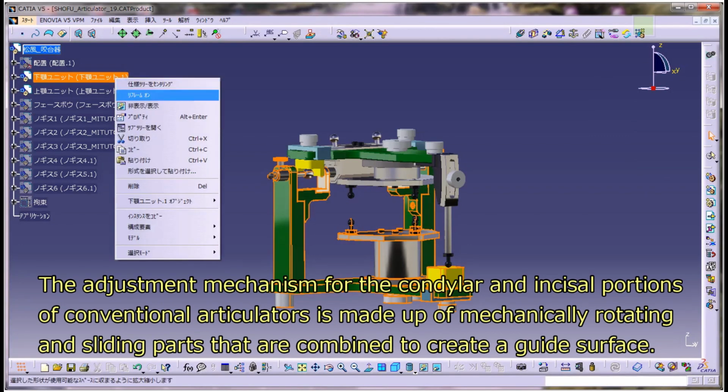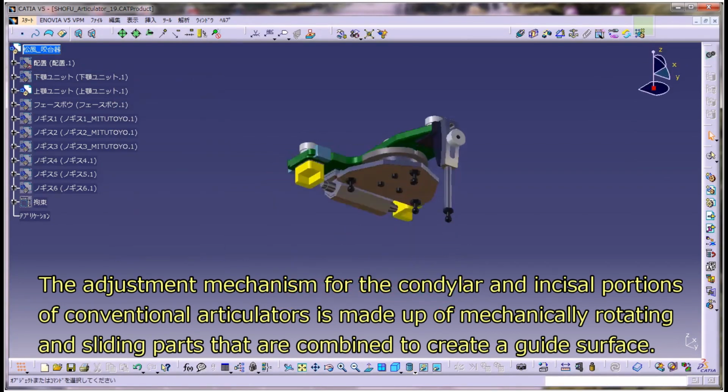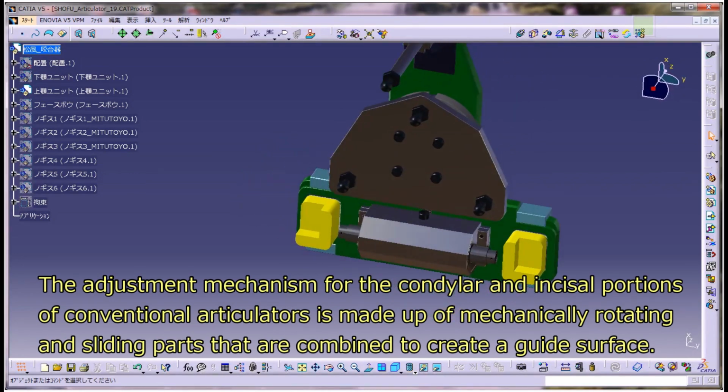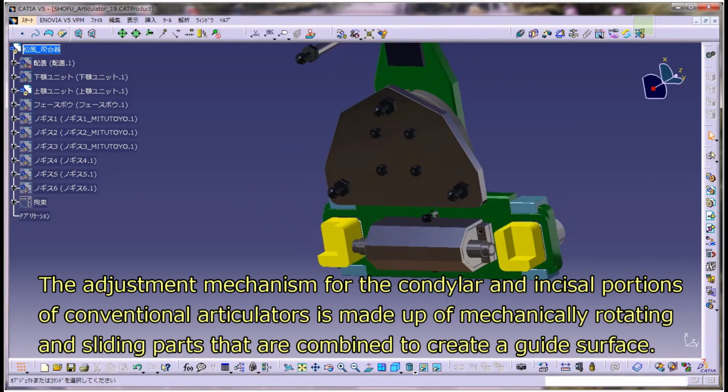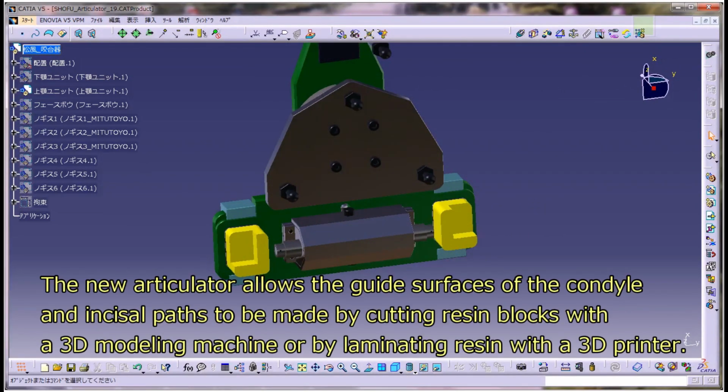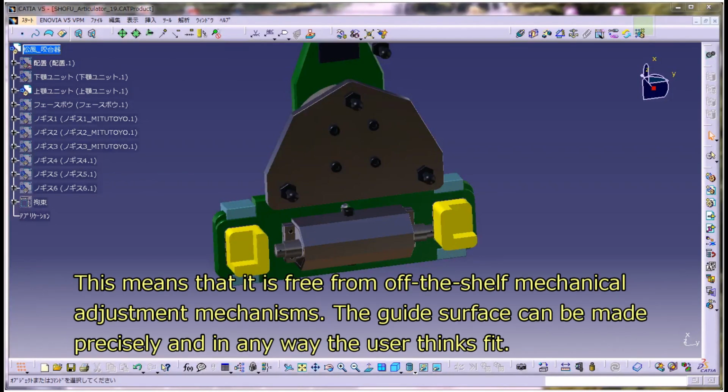The adjustment mechanism for the condylar and incisal portions of conventional articulators is made up of mechanically rotating and sliding parts that are combined to create a guide surface. The new articulator allows the guide surfaces of the condyle and incisal paths to be made by cutting resin blocks with a 3D modeling machine or by laminating resin with a 3D printer. This means that it is free from off-the-shelf mechanical adjustment mechanisms.